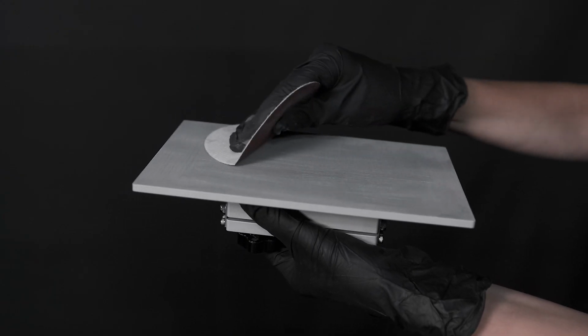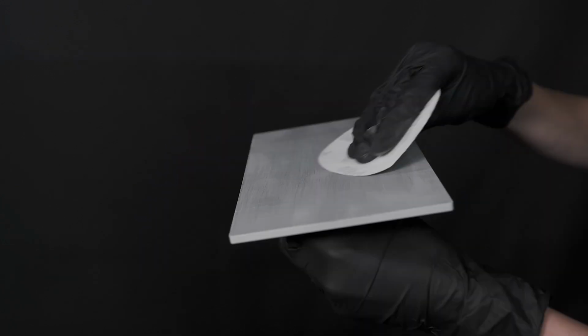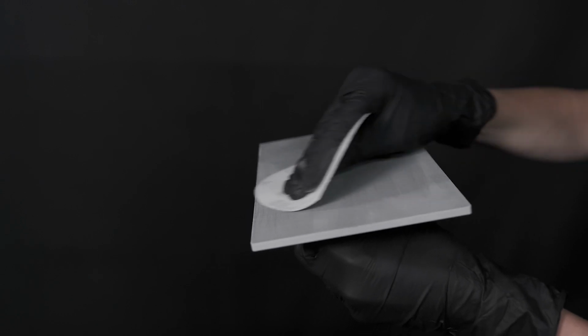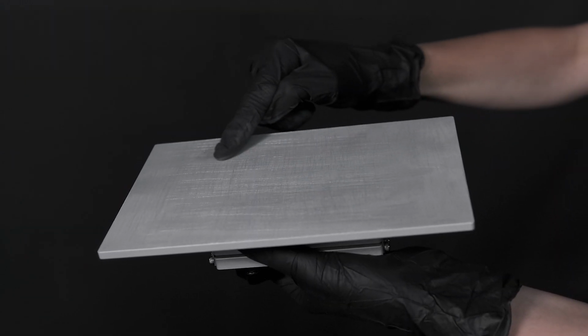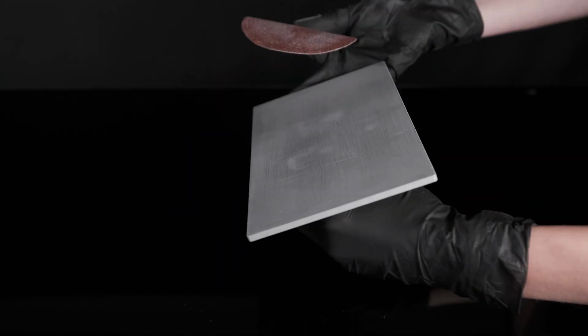In case the model does not adhere, it is necessary to roughen the plate surface with 80 grit sandpaper, placing it first horizontally and then vertically. Check the surface roughness with your fingertips and repeat the same steps until the surface is rough enough.